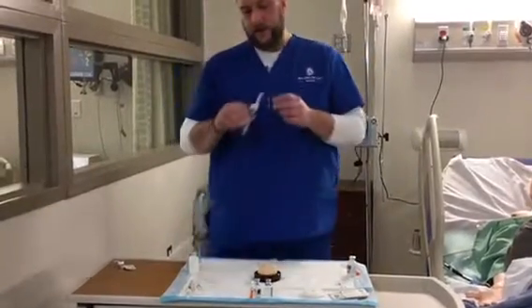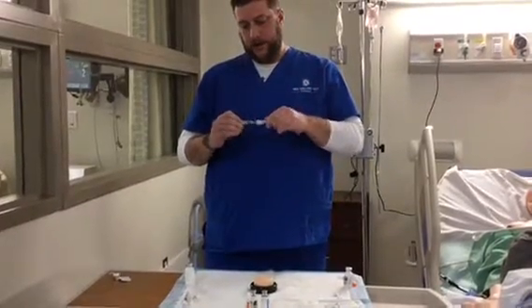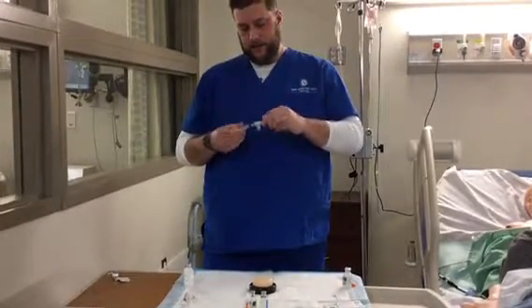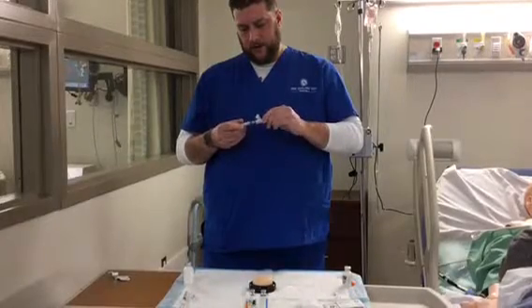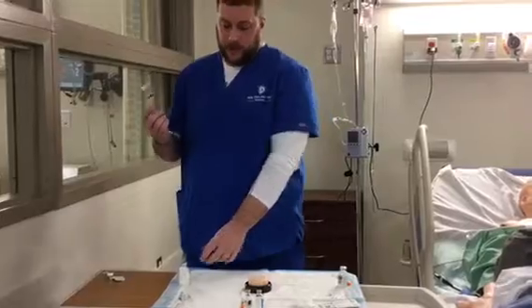Next is intramuscular. This is a little bit larger. What you want to do is the same technique. You want to withdraw. Say for this one we wanted 2 milliliters.